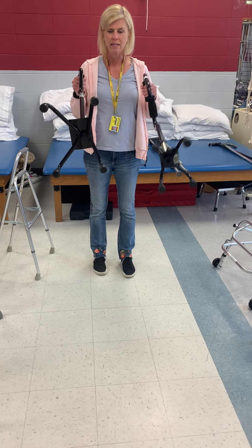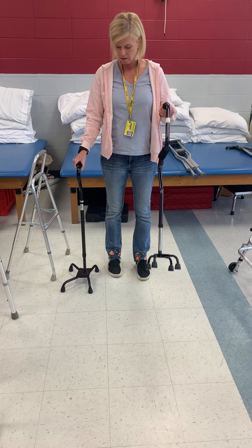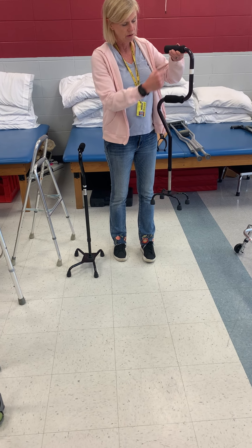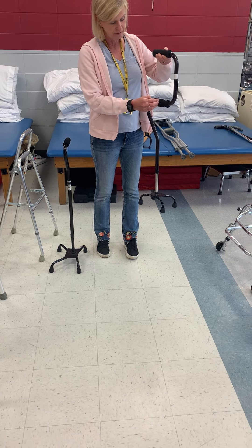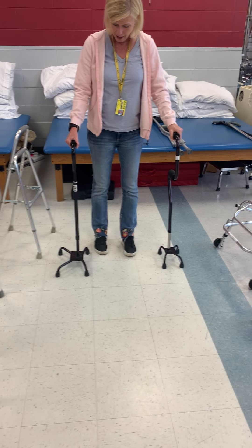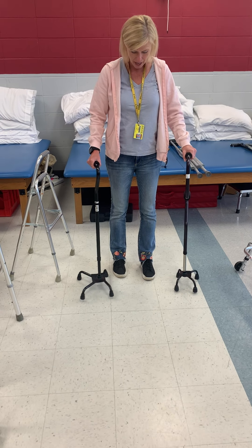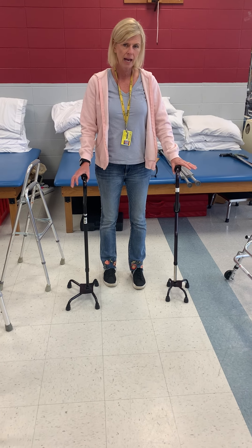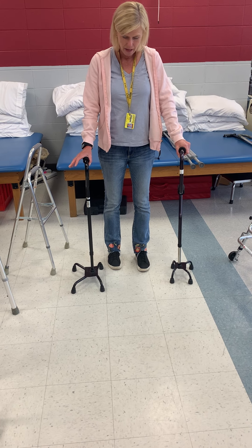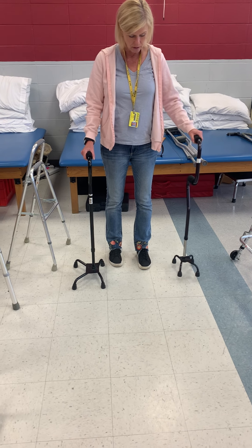So quad canes — this is a wide base quad cane and this is a small base quad cane. This is also called an off-shaft cane because it's off the shaft. Personally, I'm not crazy about quad canes. I don't think they offer that much more stability than just a regular straight-line cane, and I find that people get their toes caught on them.